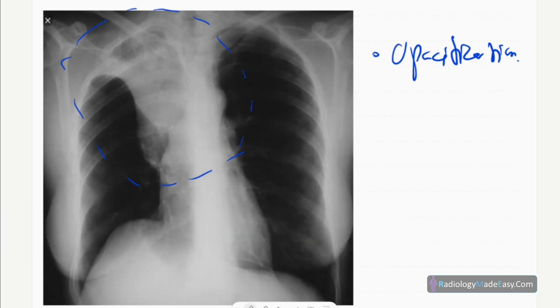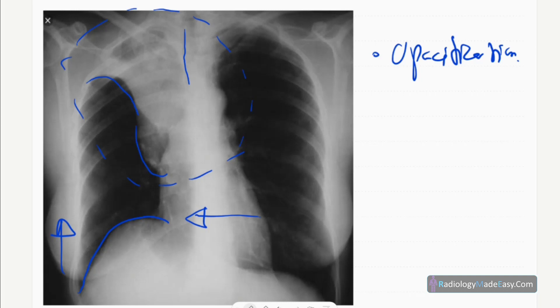There are no air bronchograms, air fluid levels, calcifications, or cavitations in that opacification. Underlying bones are also normal with no erosions. You can see upward bulging and downward bulging of the horizontal fissure at the hilar region, and there is slight deviation of the trachea to the right side.